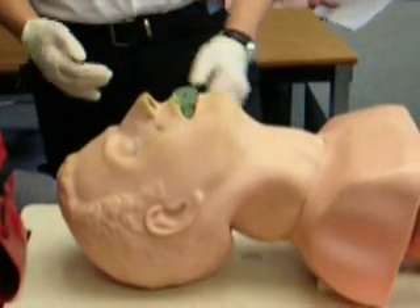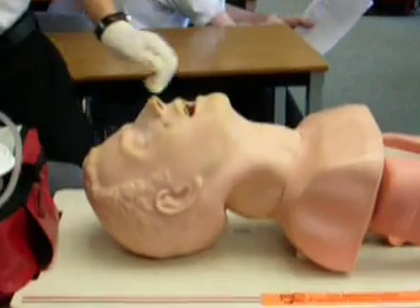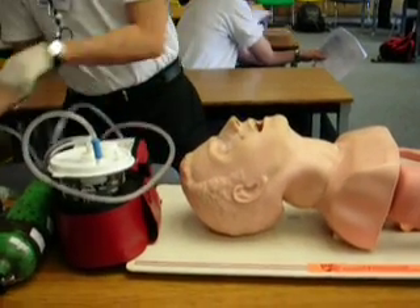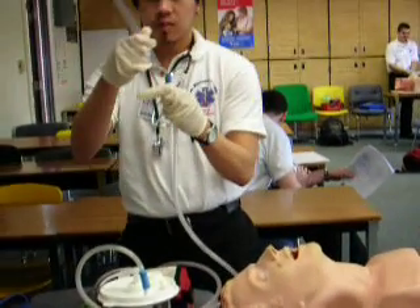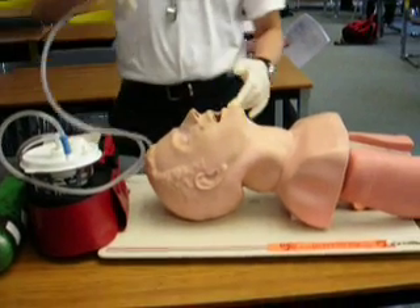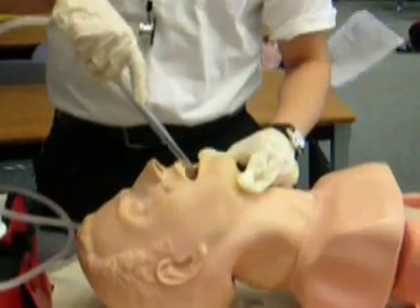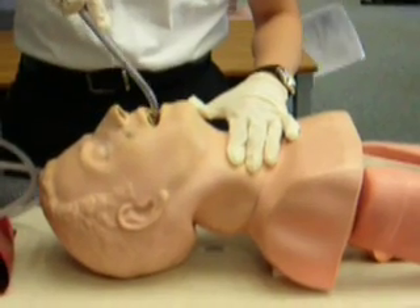The patient is now gagging, so I take it out. I get the suction machine, turn it on, and see if it's working. I insert the hard tip, make sure I don't have suction while inserting, then I put it in and suction for no more than 15 seconds, and bring it out.